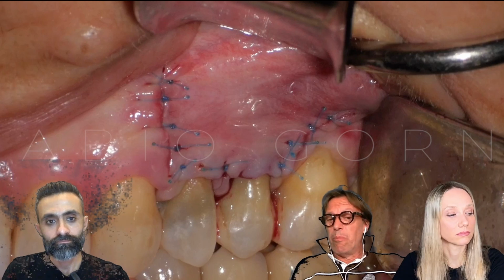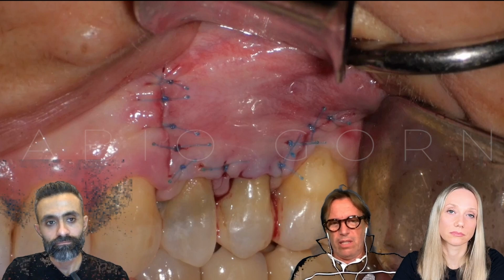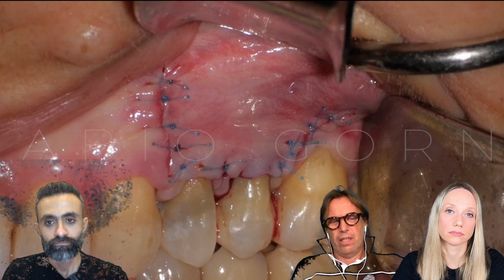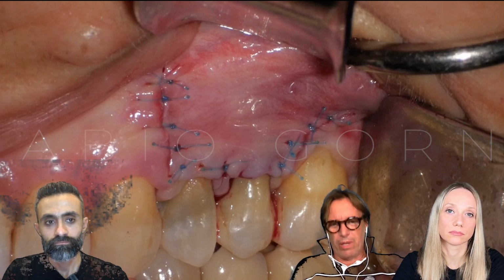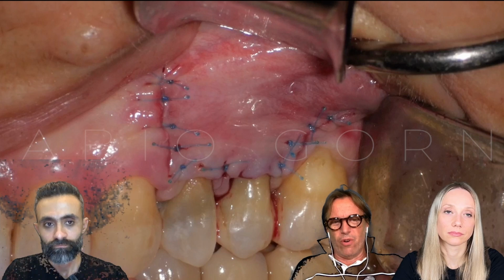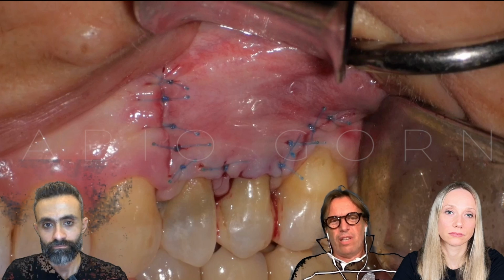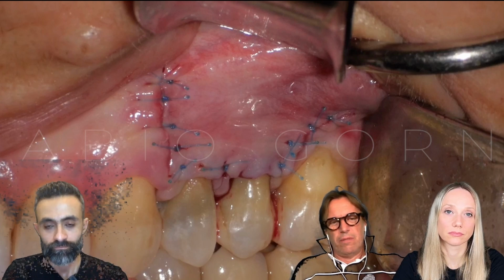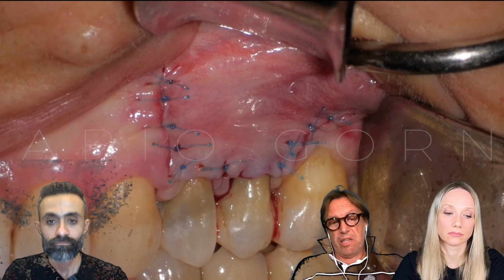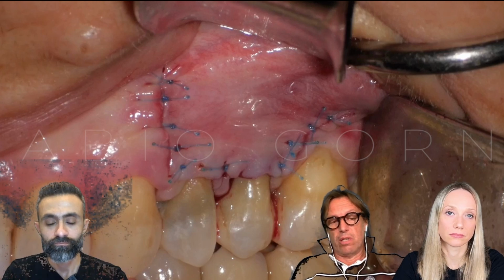What is really important is don't remove the sutures after 2 days, 3 days. Please, don't do it. Also, this is another topic where there is no evidence that you can improve the quality of your soft tissue management by removing the stitches after 48 or 72 hours. Usually it takes 7 days, 10 days without any problems. And usually no scars, absolutely no scars.